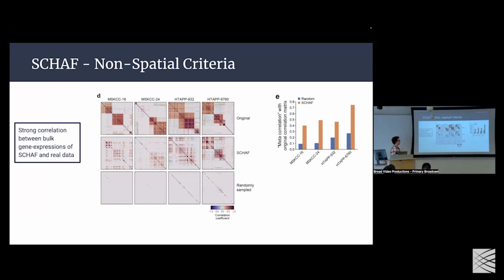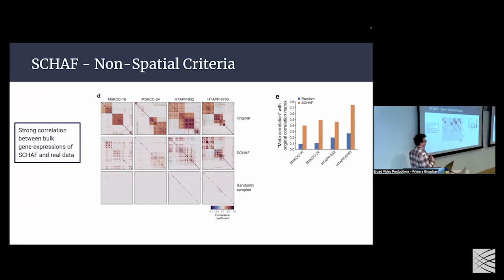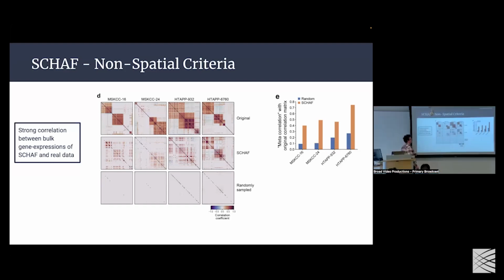The first thing then we can look at is correlations between different genes. Our top row is each of these evaluation samples. We have 4 that we're looking at here. You look at the single cell data set for each of these 4, and you see how strong the correlation is between gene X and gene Y in general. And you can get a correlation plot that looks very pretty.